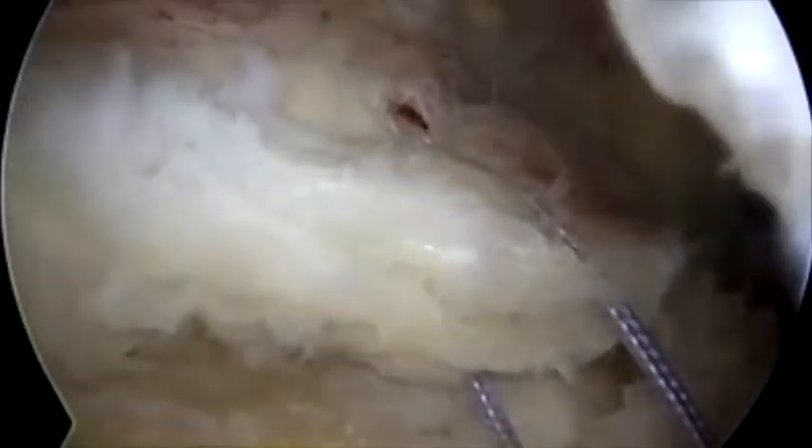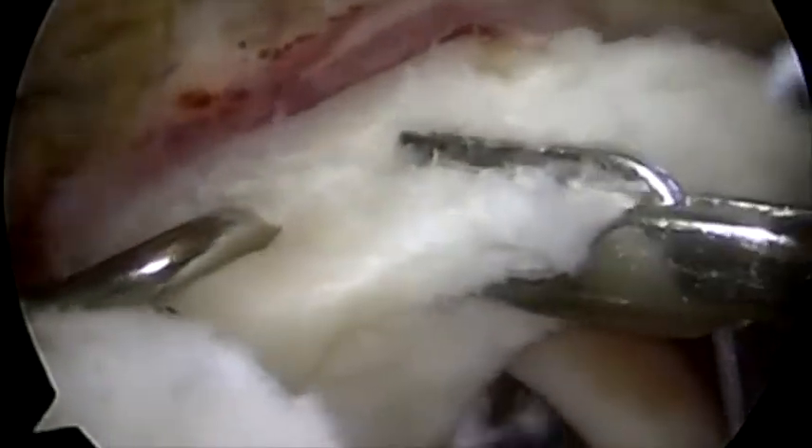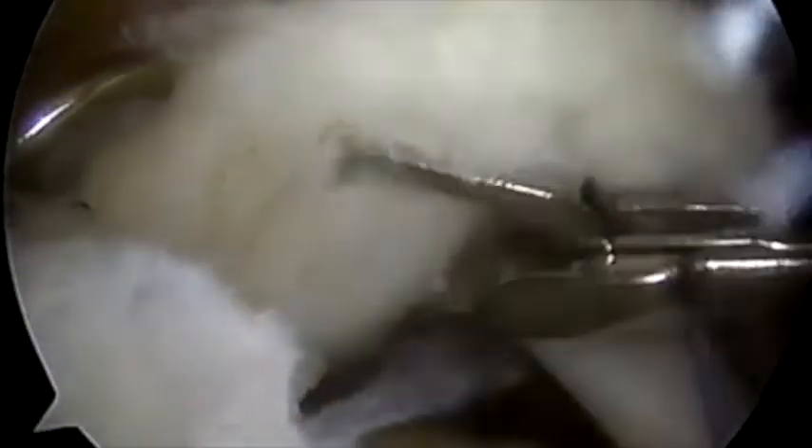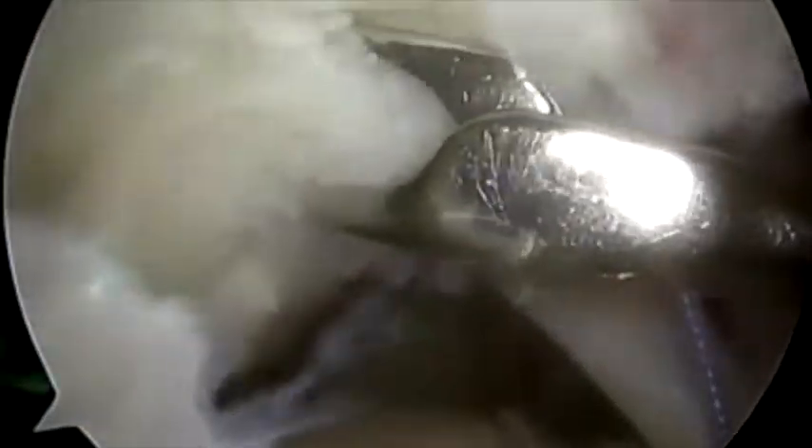The arthroscope is placed in the lateral portal and the tear again identified. The tissue manipulator is used to grasp the tendon edge and a curved suture hook is passed through the full thickness of the tendon. The wire with the kite is retrieved along with one limb of suture from the previously placed anchor.